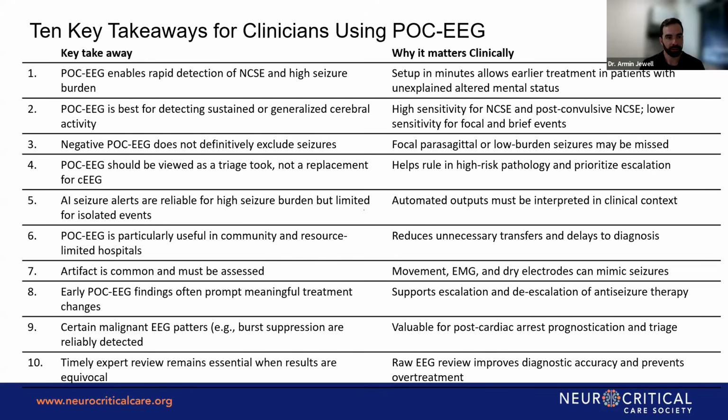And it's best for detecting really sustained activity. Again, it has lower sensitivity for focal or brief events, and it's not as sensitive for interictal discharges. We have also mentioned before that parasagittal seizures or low burden seizures may be missed because it does not definitively exclude seizures. Again, it's a triage tool and not a replacement. This is why it's important to know the limitations and the strengths of using point of care EEG.